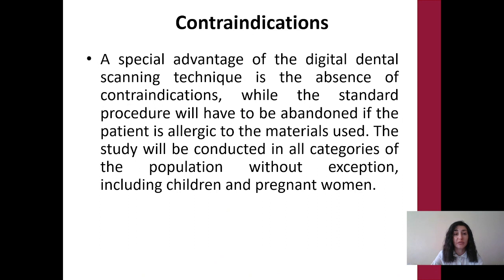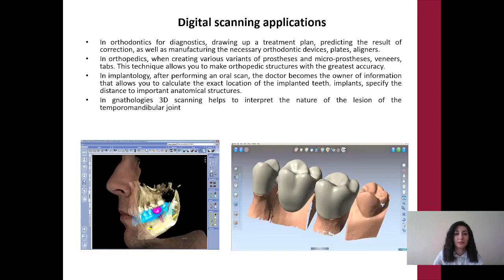Contraindications. A special advantage of the digital dental scanning technique is the absence of contraindications, while the standard procedure will have to be abandoned if the patient is allergic to the material used. The study can be conducted in all categories of the population without exception, including children and pregnant women.